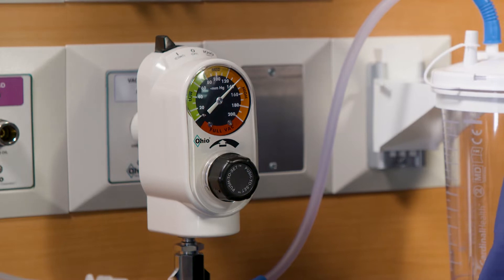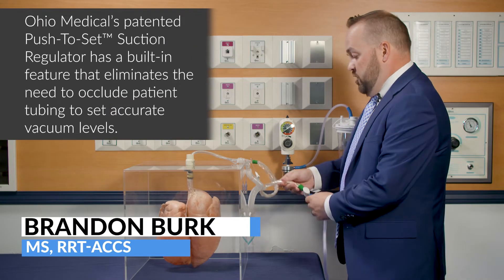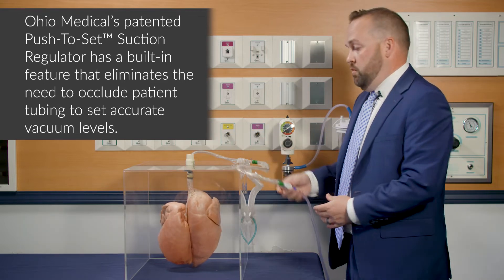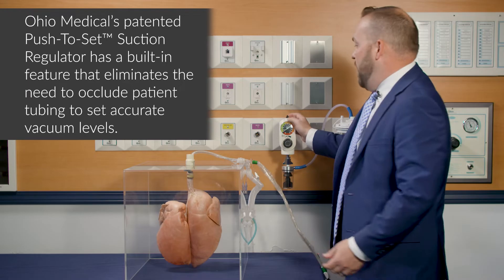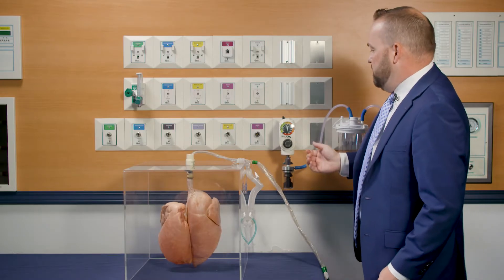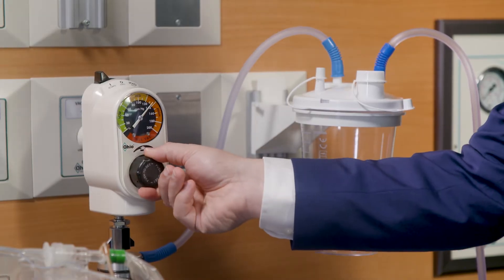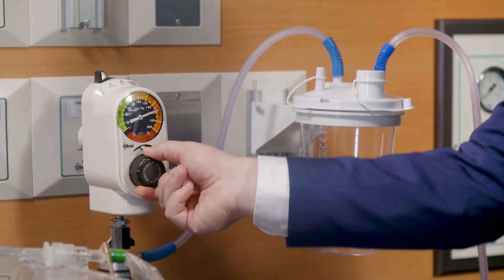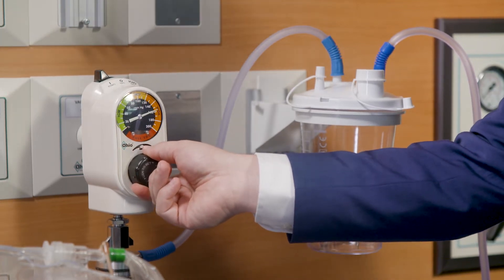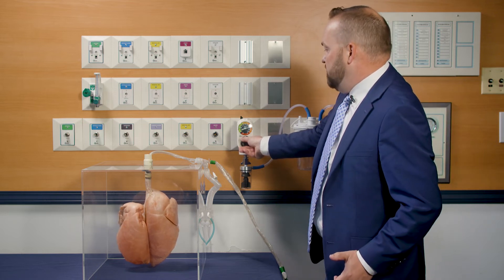Ohio Medical has patented technology called Push-to-Set. Rather than using an occlude-to-set procedure, you can keep your appliances all intact — you don't have to take any tubing away. You power on the device, and once it's on, you can't turn the knob without pushing the button in. Once you depress the button, you can adjust the suction pressure, and it automatically completes the occlusion procedure for you.